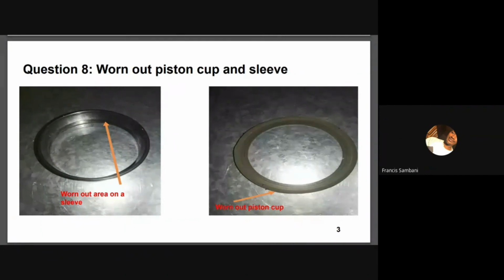And if you find out that it is still failing, what you need to do now is go to the sieve beds and try to refill the sieve beds. Remember that when you're refilling the sieve beds, you should always do it when the humidity is less than 50%, because zeolite also has an affinity for water, so you might end up damaging the zeolite. After you've done these two things, I believe this would solve your problem.